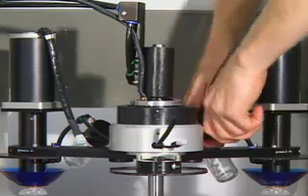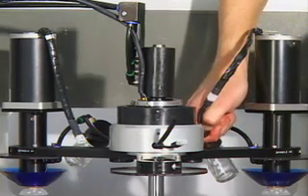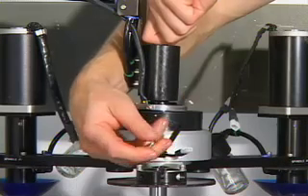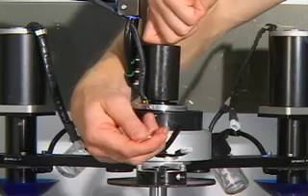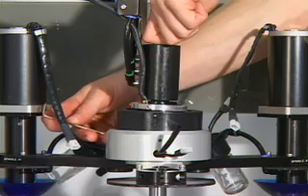As you push the rotary union and brush block into hub, pull on the tubing to ensure they do not kink. Once in place, tighten the three set screws on the swing arm hub to hold brush block and rotary union in place.